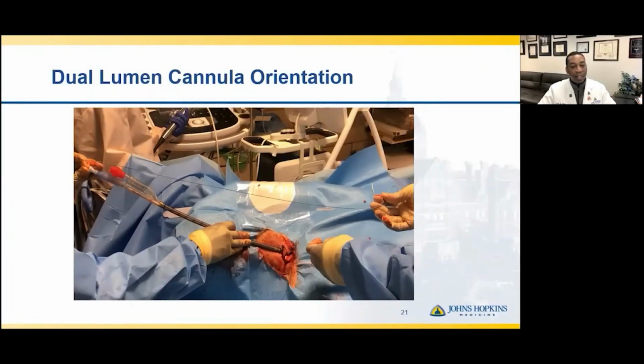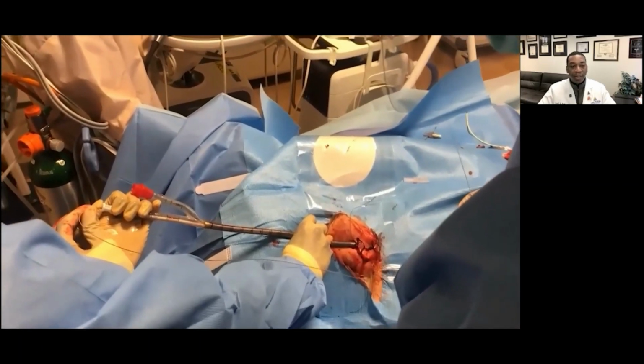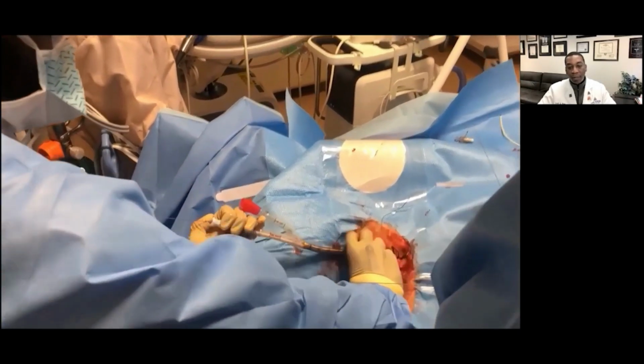And so notice here, the surgeon who's at the head of the bed will get his or her hands in the correct position so that this can be a safe and controlled deployment, while the assistant is going to maintain the guide wire in the proper position and make sure that it doesn't get advanced or retracted during that deployment. You'll notice this all happens quickly here. My hand is to the left and above the surgeon's hand. The surgeon's thumb will hold the dilator in place to make sure it's not retracted during this nice controlled deployment.